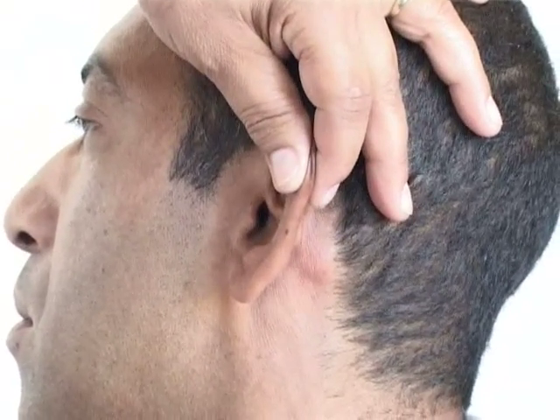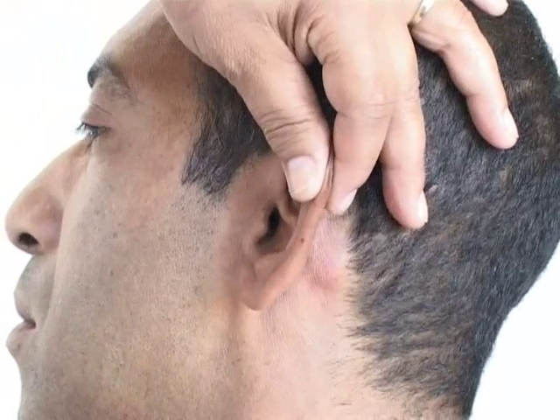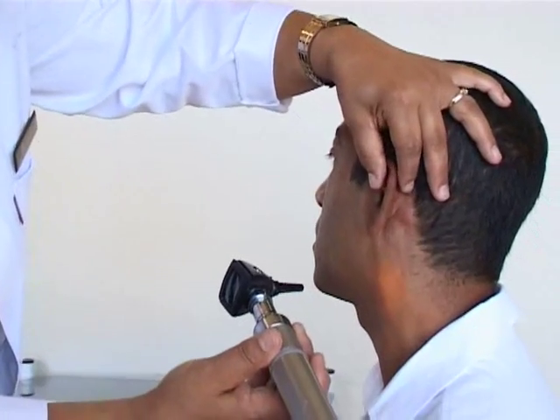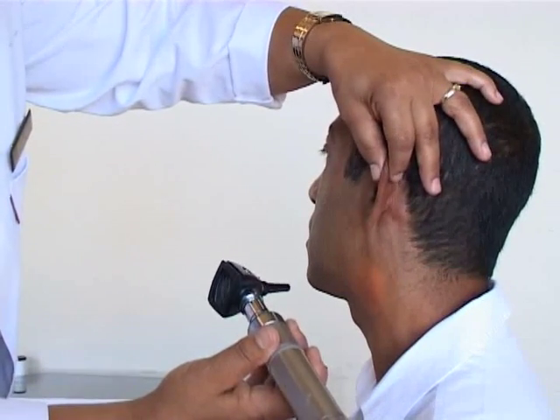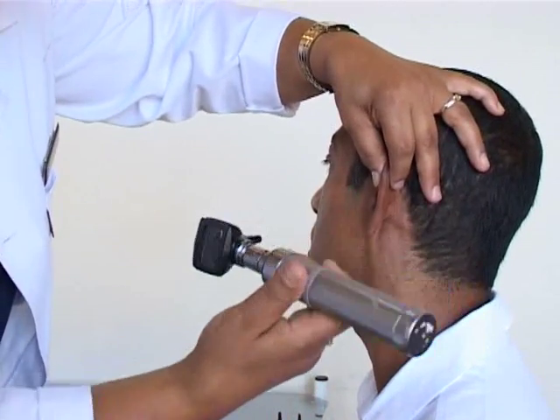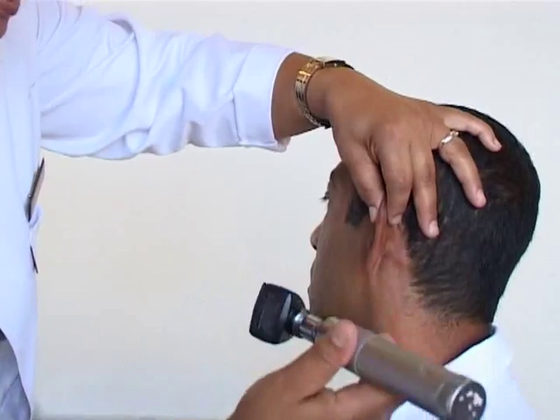But now, if we go in with the otoscope to examine the external auditory canal and the tympanic membrane, there are normal features that we must look at. We said we're going to pull the ear up and back for the adult, and while we're doing that, we're straightening the ear canal so that we can focus on the tympanic membrane.